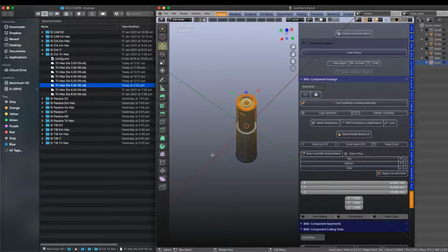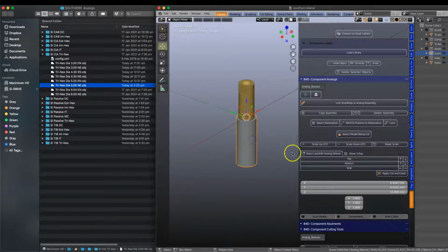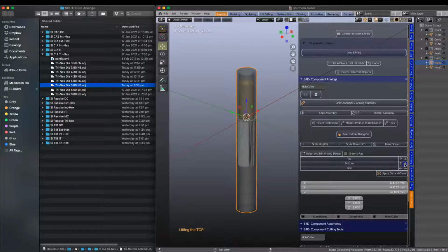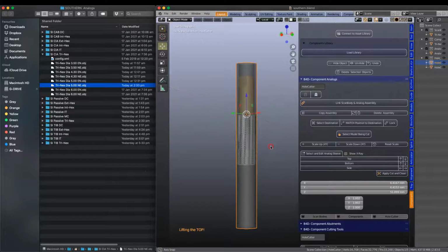Okay, so I'm going to just test it for safety measures. We want to just go here, select it, and then we're going to use the arrows this time, using it up, and then we're going to select the bottom, and then we're going to go down. Now this is the cutting tool which will cut through the model. So it's all fully functional, and then from here on we'll be making our way onto the abutment library. So the analog library is fully compatible this way.